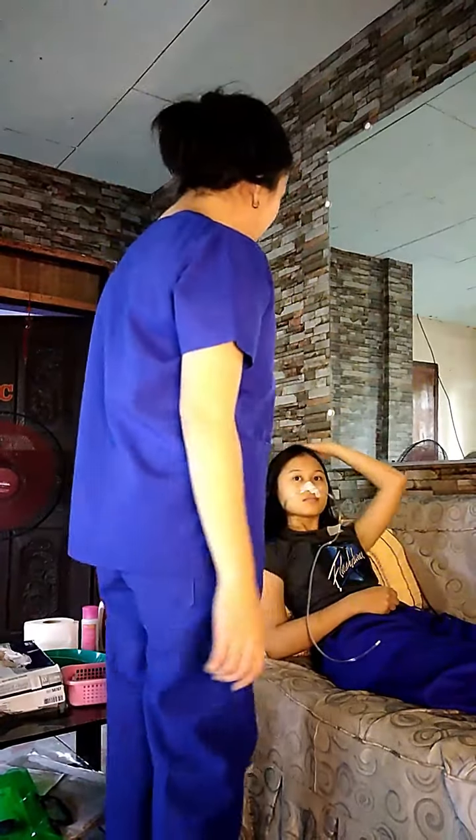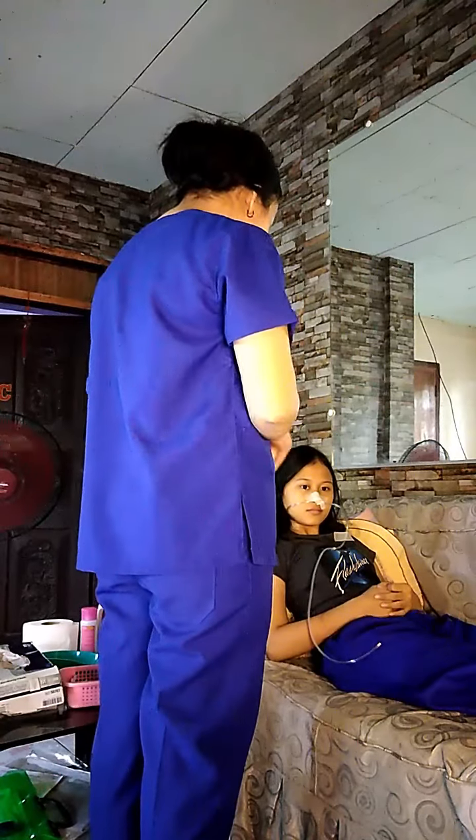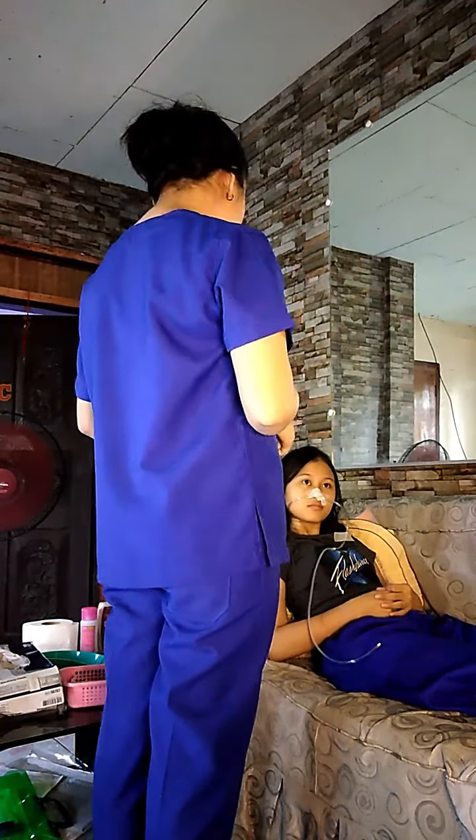We have already prepped the equipment. I will now be introducing myself again to the patient, verifying the patient's identity, explaining the procedure, performing hand hygiene, and wearing PPE. So, hi ma'am. I'm here again after 3 days. I am Maricon Suñas, your student nurse. I am the one who inserted your NGT.